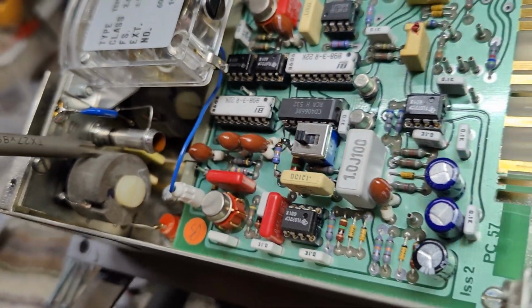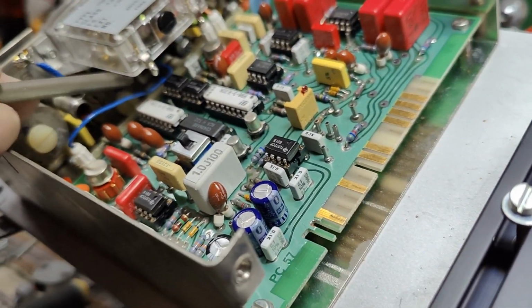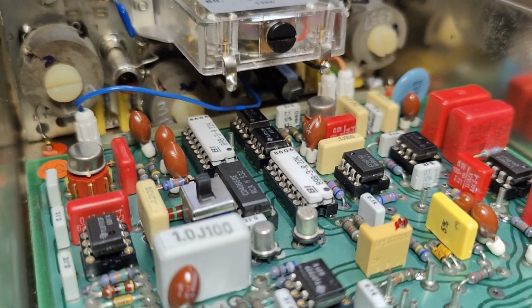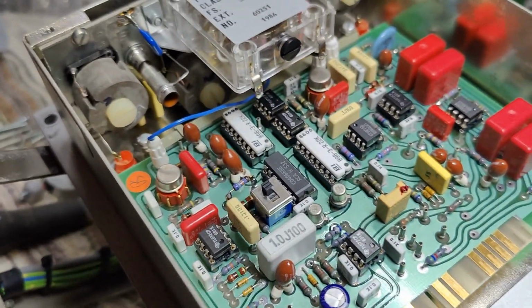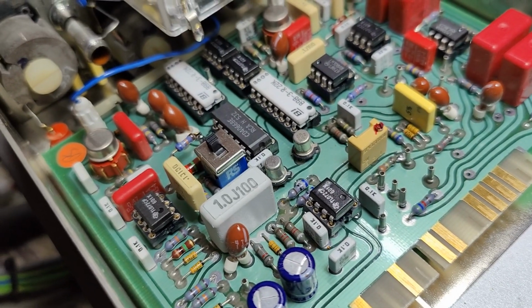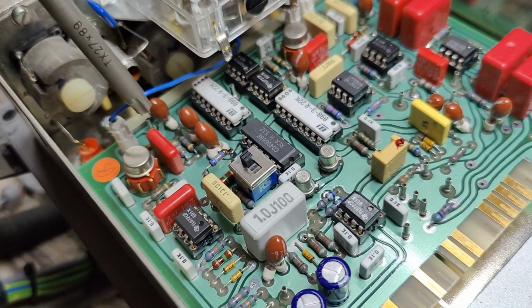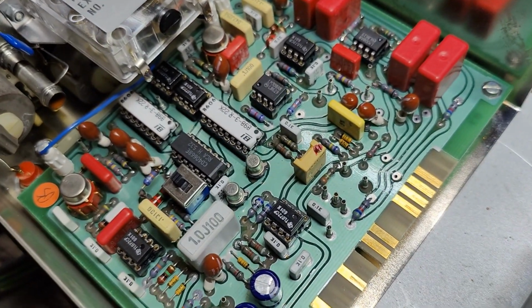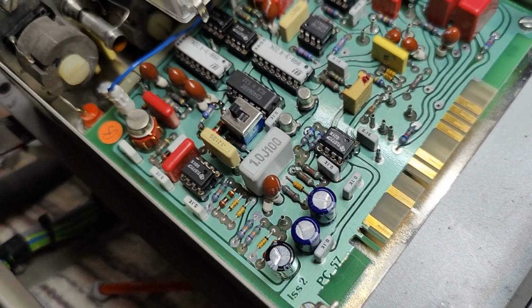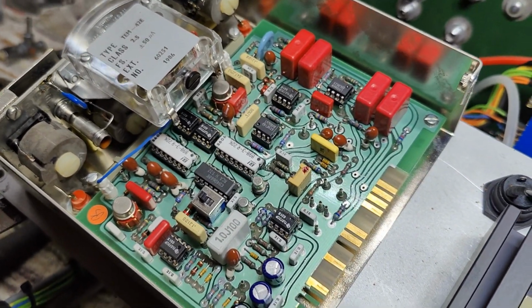So there's definitely a resonant circuit with the inductors, capacitors, some more inductors, and some more stuff going down here. We can't really see exactly what is going on. We've got probably some power or drive or some amplifiers and some stuff that goes down to this front end circuit. So that is what I think we have here. Yeah, some high frequency oscillator, resonator, detector or something. I haven't yet figured out exactly how that works and what is going on, but so far that is what we know.